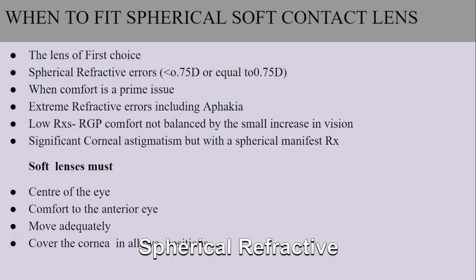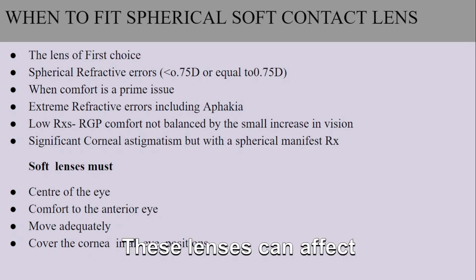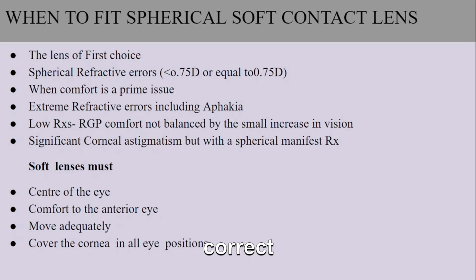Number 1. Spherical refractive error. Spherical soft contact lenses are often the lens of choice for individuals with low refractive error, specifically those that are less than or equal to 0.75 diopters. These lenses can correct mild nearsightedness or farsightedness without the need for additional correction, such as toric lenses for astigmatism.